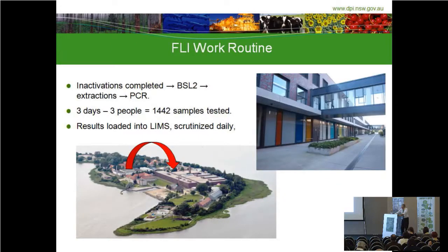An important aspect of this project was that there's been a debate in Australia, in the US, in Canada particularly: do we do all of our FMD exclusions in a BSL-3 facility? And in Germany, like us in Australia, like the US, the consensus is that we will inactivate the samples but do all of the large volume work under BSL-2 facilities. And so that's what actually happened in this project.